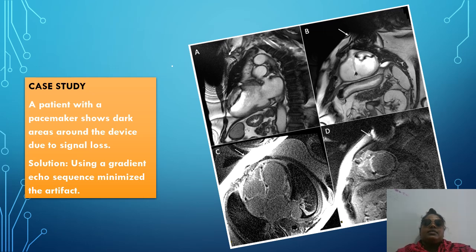Okay, this is the case study that I can show to you. A patient with a pacemaker shows an area of signal loss around the device. Using a gradient echo sequence minimizes the artifact.